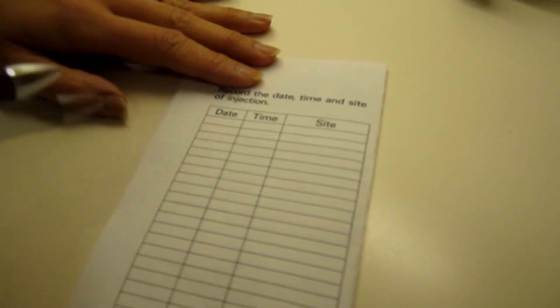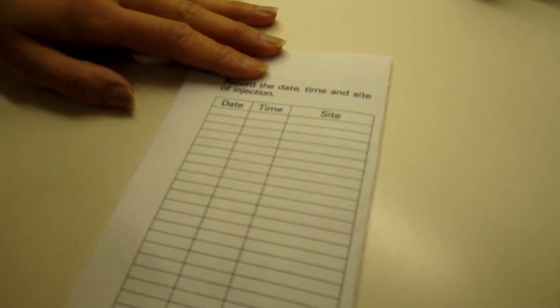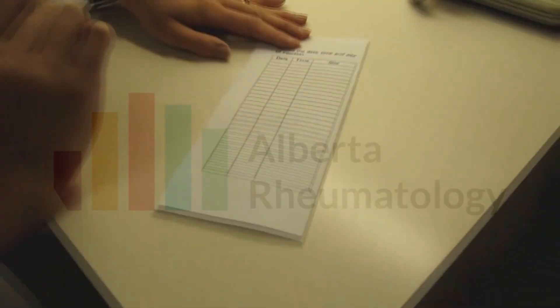Rotating our sites avoids scar tissue buildup and in the end it will allow for better absorption and better effects of your methotrexate.